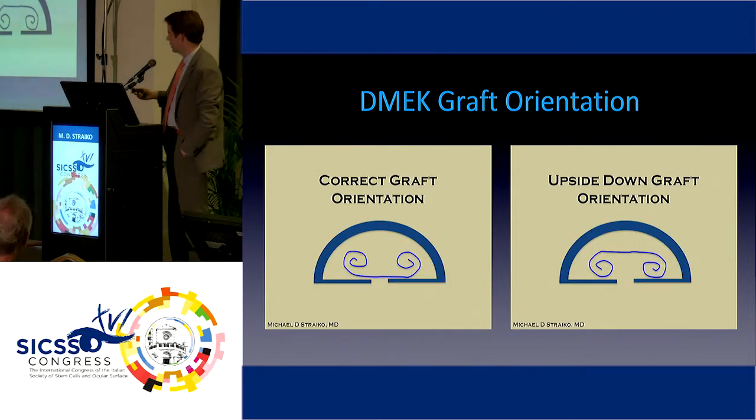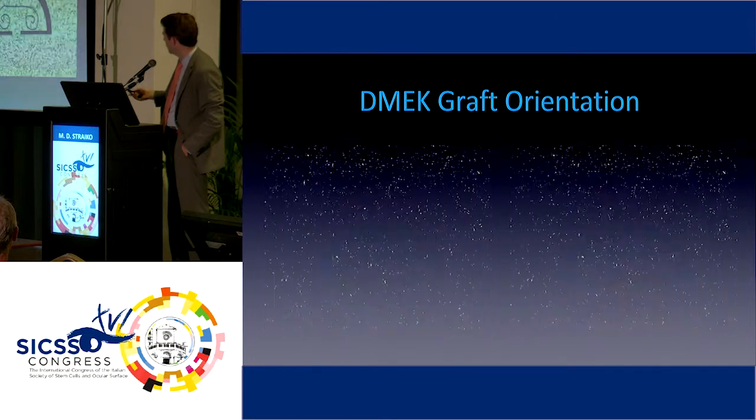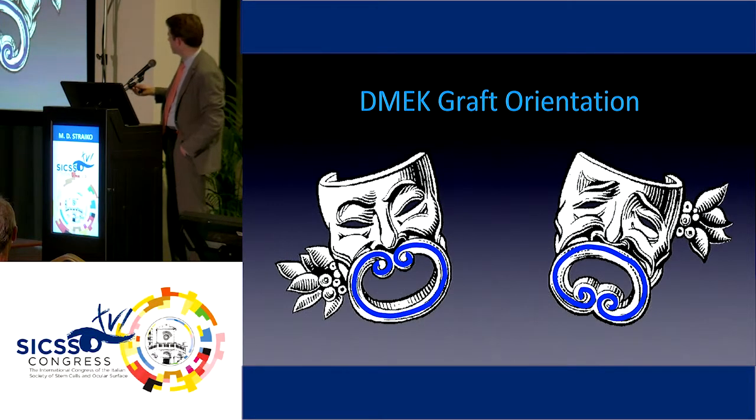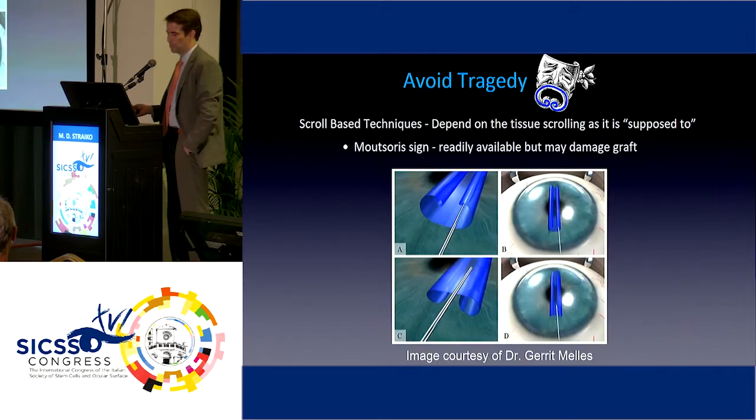So again, to look at the correct graft orientation on the left, the endo is on the outside of the scrolls, so it should be how it is on the left. It's easy to remember. Correct on the left, incorrect on the right, so you have either comedy or tragedy. So avoiding tragedy, that's our goal here. First way to avoid tragedy is using scroll-based techniques.